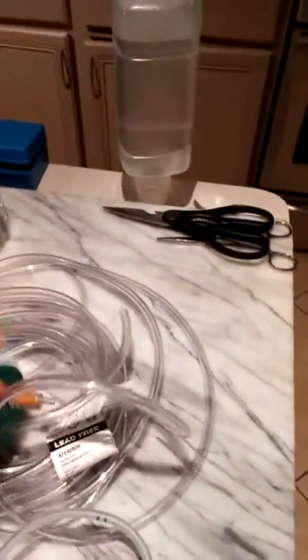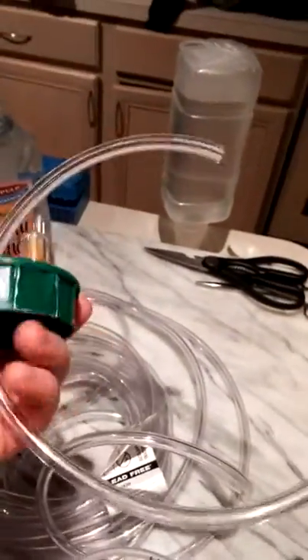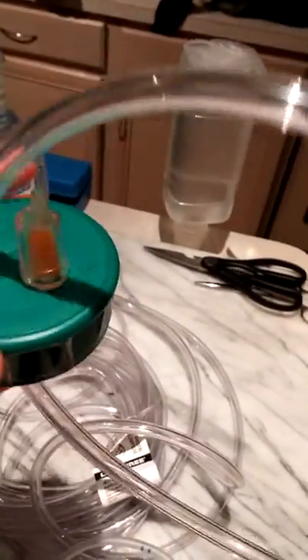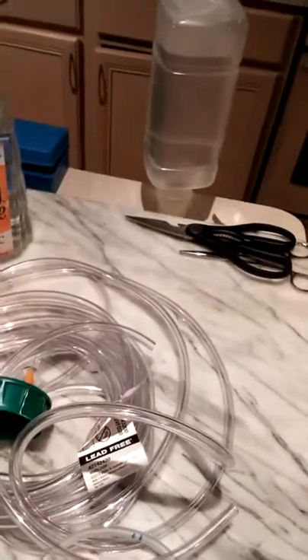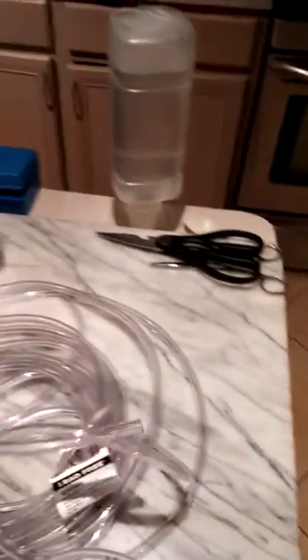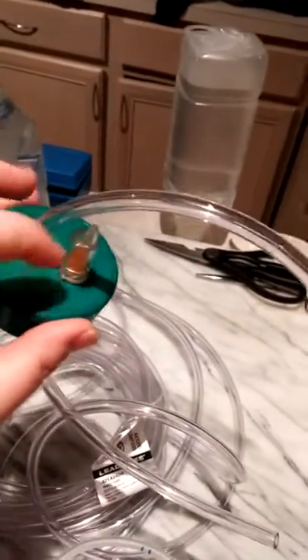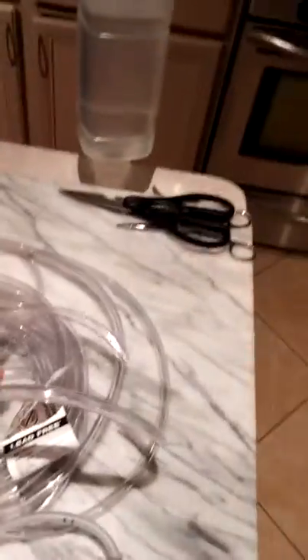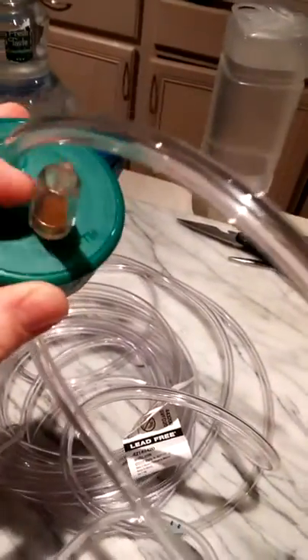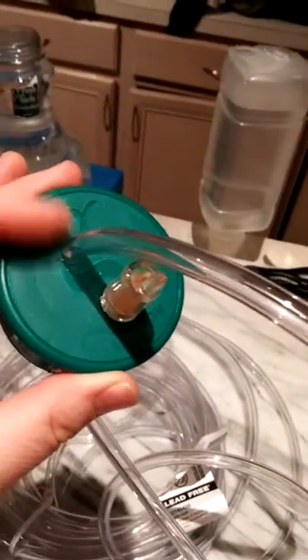I got a drill bit and went smaller than what you think you'll need, because you want it to be as airtight as possible to avoid contamination. For the big hole I used a 1/4-inch drill bit with a handheld drill, and for the little hole I used an 11/64-inch bit and then widened it just a little bit so I can get a very tight seal.